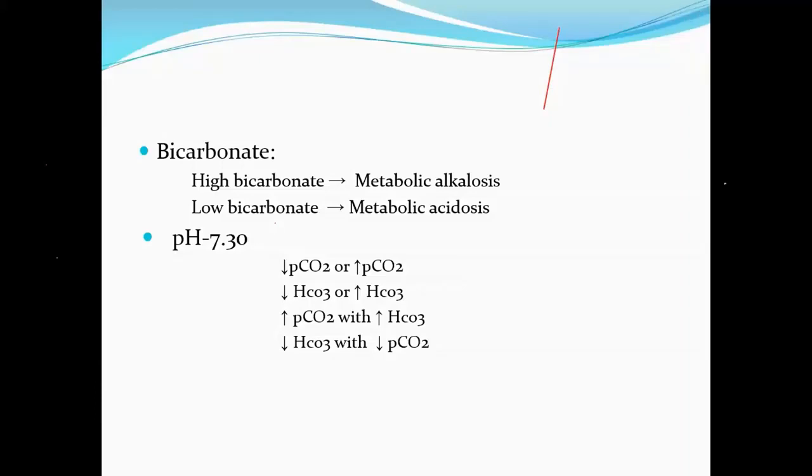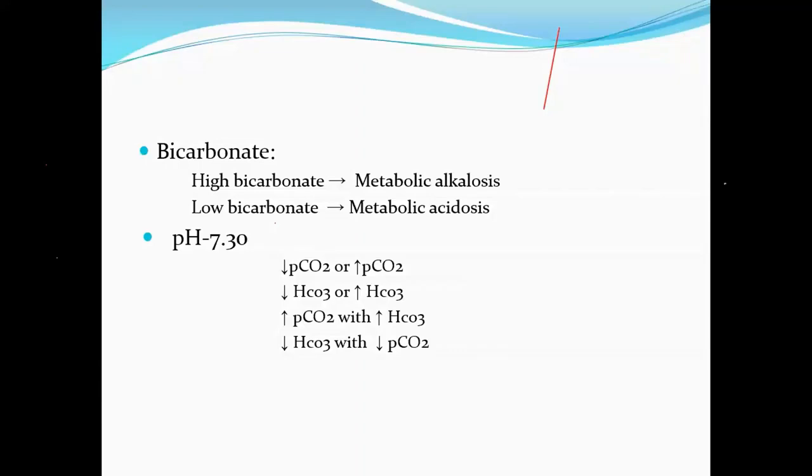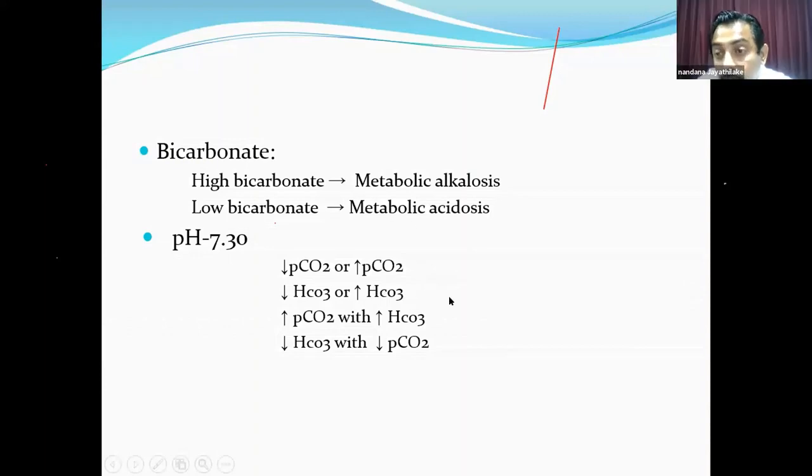No, no. Okay. So can it be due to high carbon dioxide level? Yes. So this pH, you have to look at the pH and then the carbon dioxide level here. The contributing factor for this pH is increased PCO2. Good. So we have not yet determined whether it is respiratory or bicarbonate.